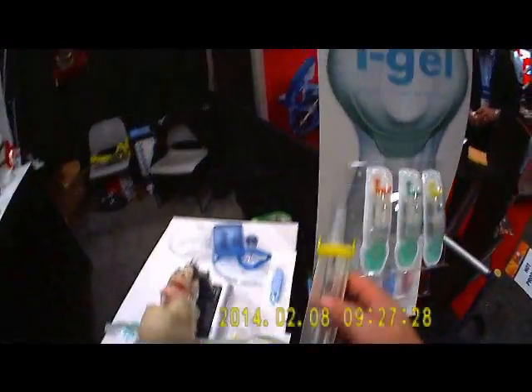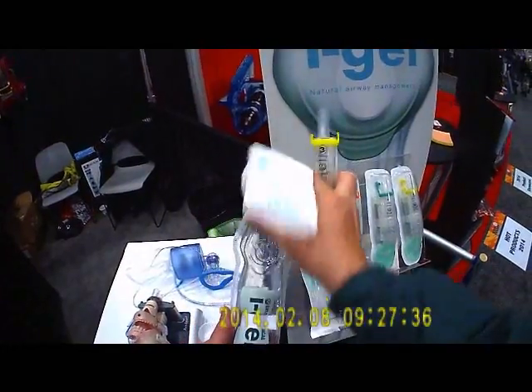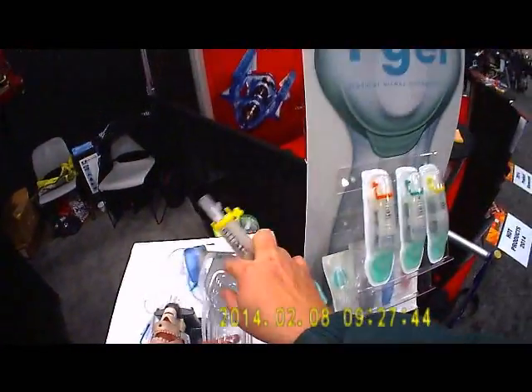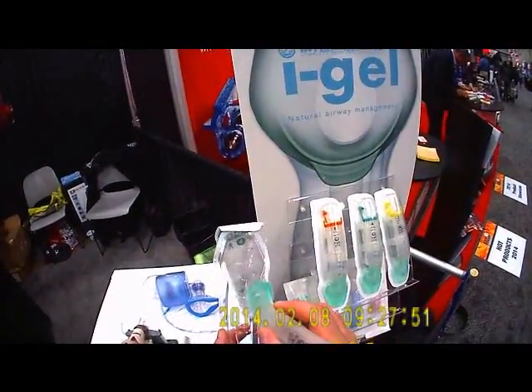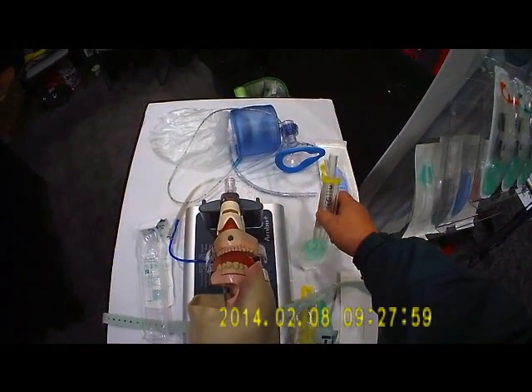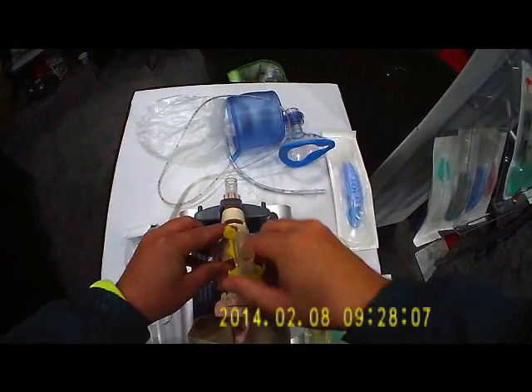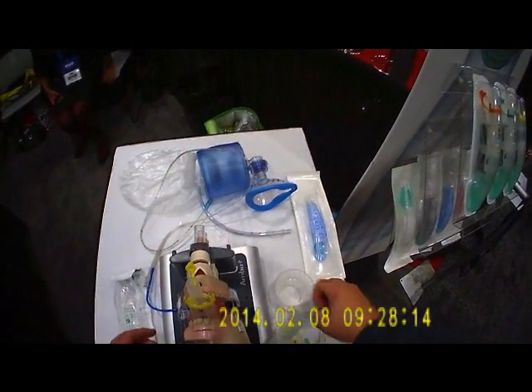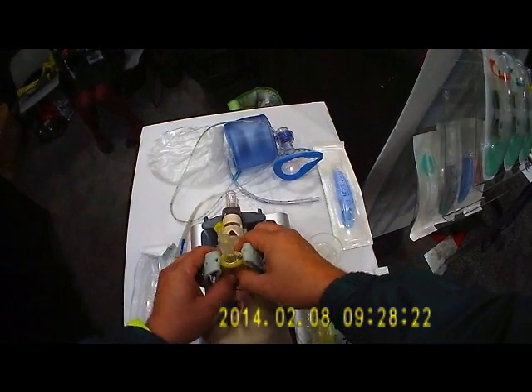These new iGels are packaged in what they call the resus kit. It comes packaged with a tube restraint and a packet of water-soluble lubricant. You squeeze your lubricant into the container and wipe your iGel through it — back side, left side, right side, and bottom. Then you simply run it down the back of the hard palate until it seats, hook up your oxygen, and ventilate your patient. You can attach the tube restraint to secure it in place. It's got a rigid bite block to prevent the patient from biting through the tube.